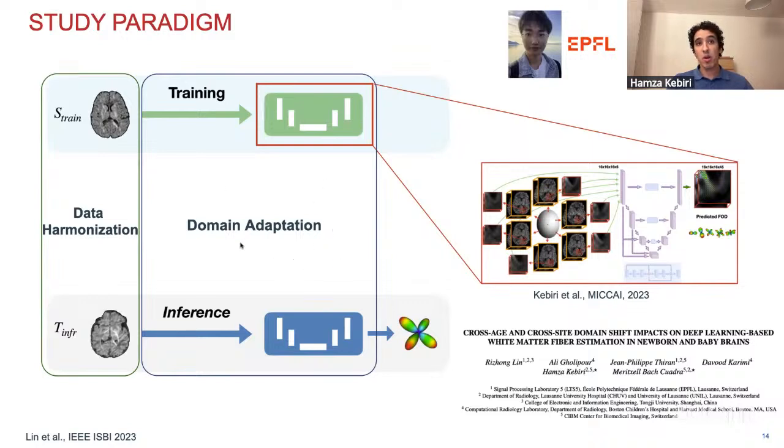And in the model, here we just use fine tuning. So we really just train on some subjects and then we fine tune on other subjects. And for this one, we use the method of moments, basically.